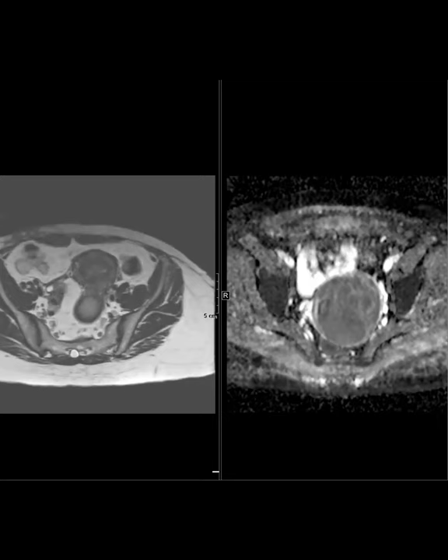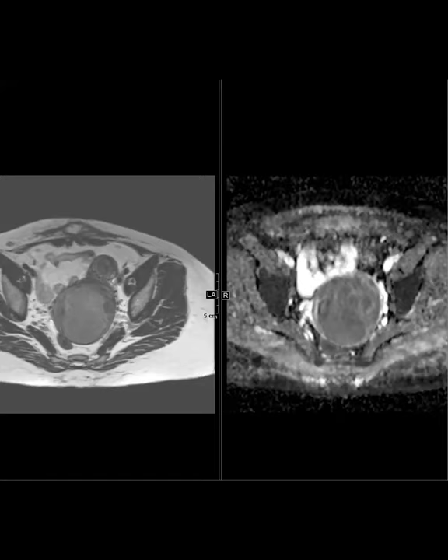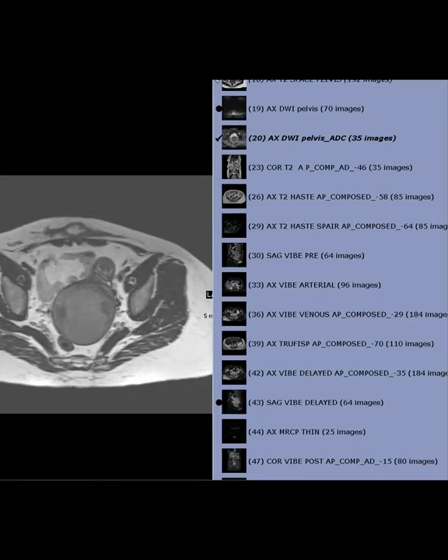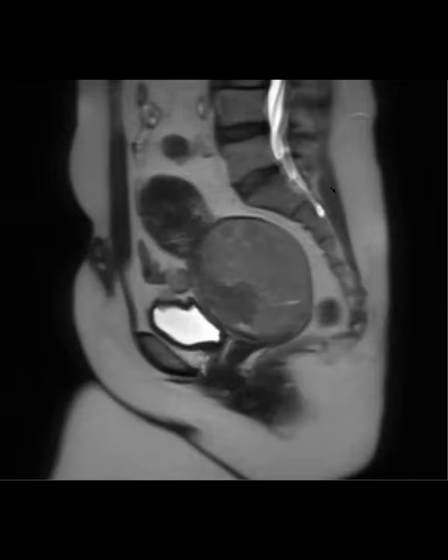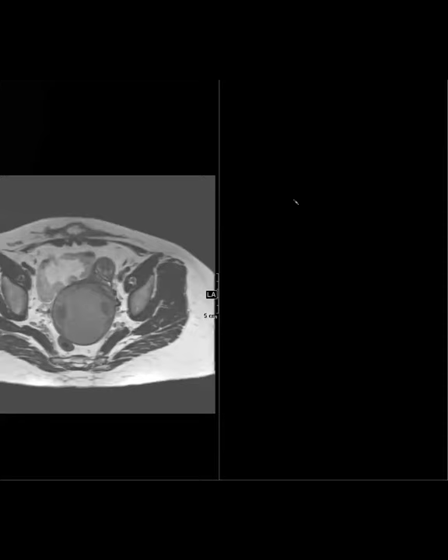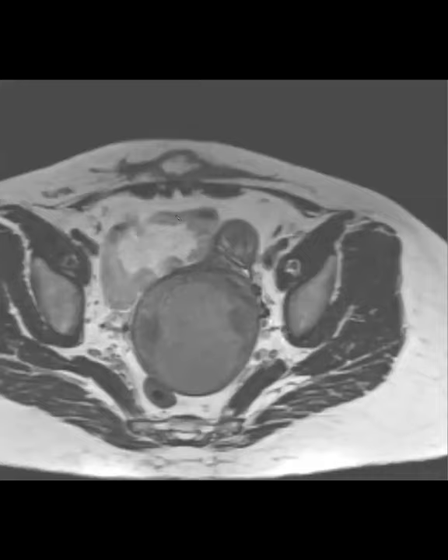Okay. Thank you. Just a point of that. There's also a happy medium, which is the STUMP tumor, where you might not be that worried. I mean, this has a diffusion restriction and it's preserving fat planes. It's not ugly, right? It's not destroying that stroma. And so you have that spectrum of STUMP versus atypical leiomyoma versus sarcomatous degeneration.